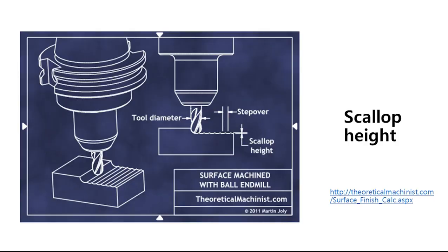Rounding line angles does not eliminate all machining errors. First, let's look at the machining errors that can be calculated. When a plane is machined equidistant with a rounded tool, it leaves a wavy area like the image. The height portion of this error is called the scallop height.